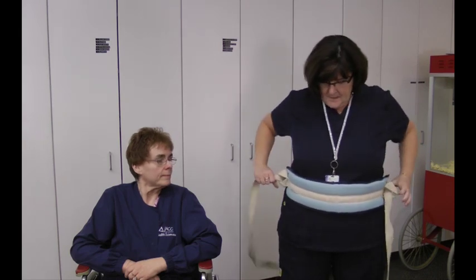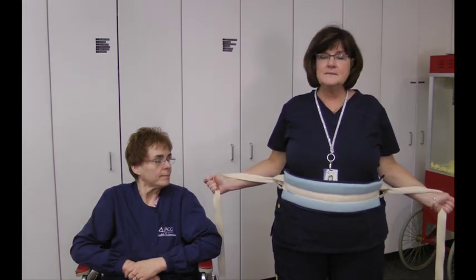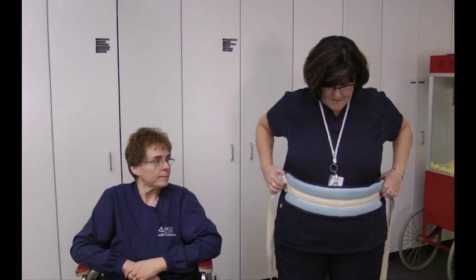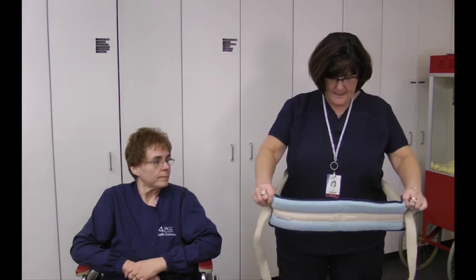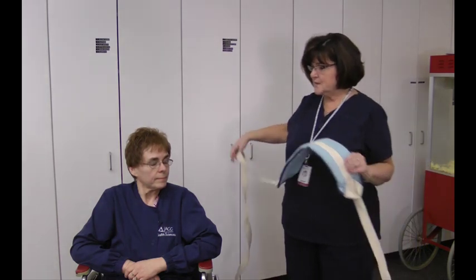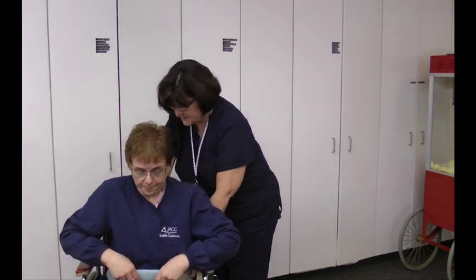Okay? This is where we hold somebody in, and then we tie these. I'll demonstrate this, but I want to make sure that you know how this waist restraint is being applied. It's so important if you're using one of these apparatuses that you do it the correct way. So Melissa, I'm going to go ahead and put this on your stomach. I'm going to ask you to lean forward.